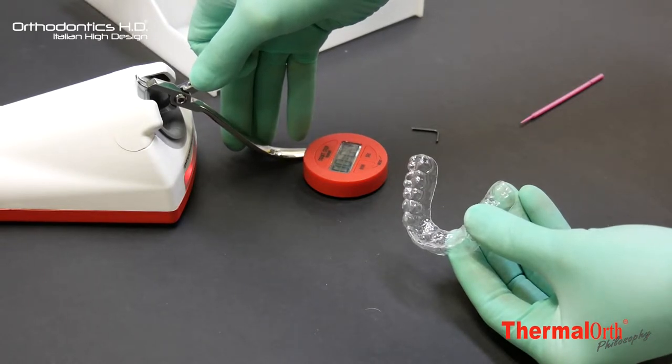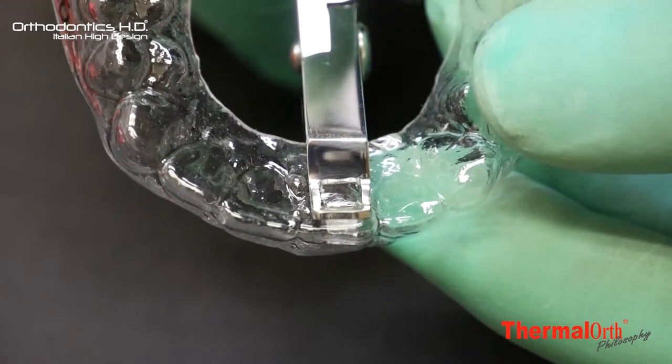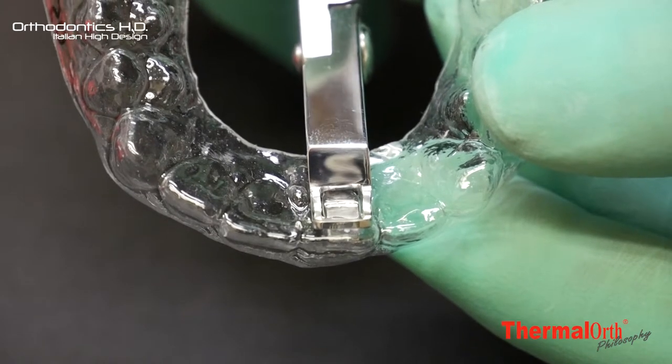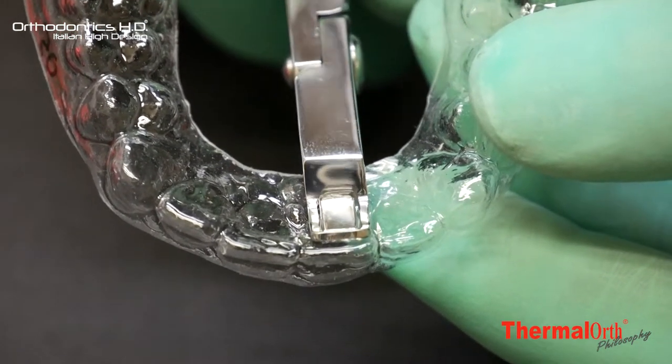Once the working area of the aligner is detected, heat the plier according to the thermoforming timetable in relation to the thickness of the plastic used and gently tighten the plier until the end of the stroke.